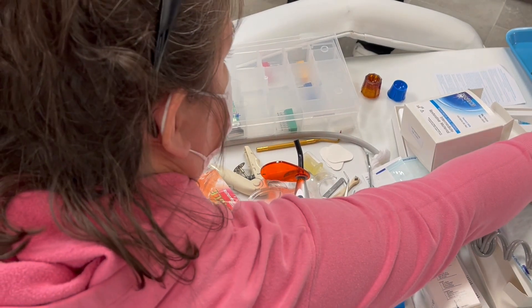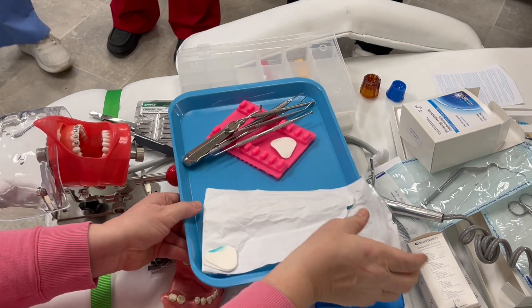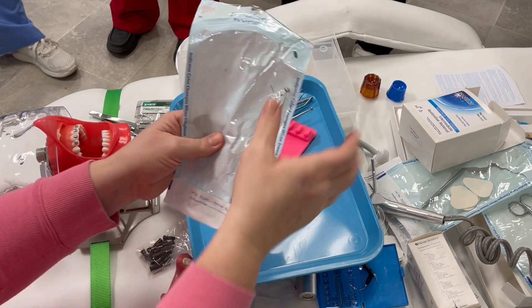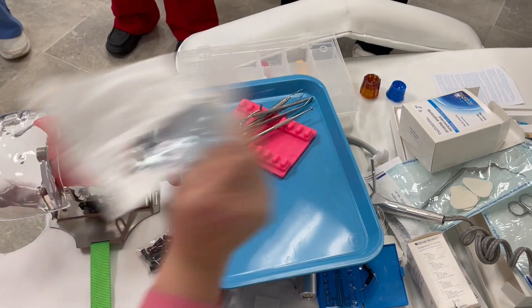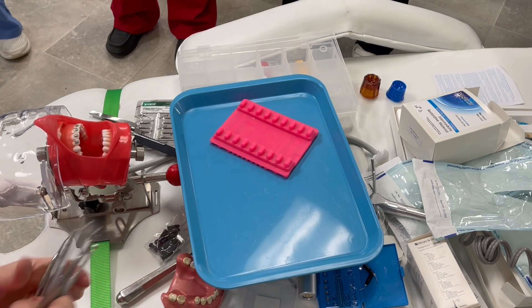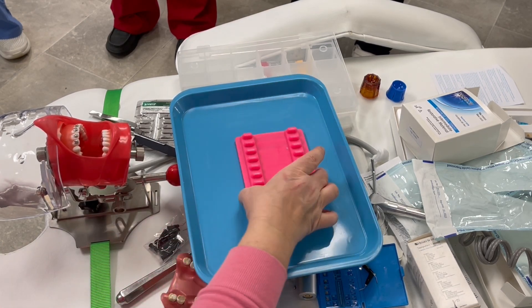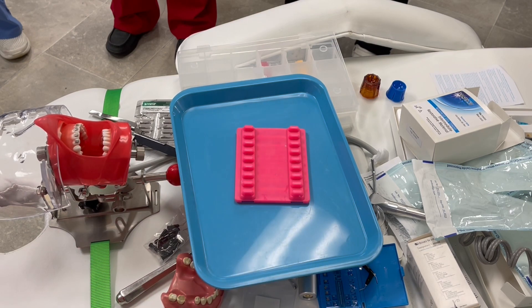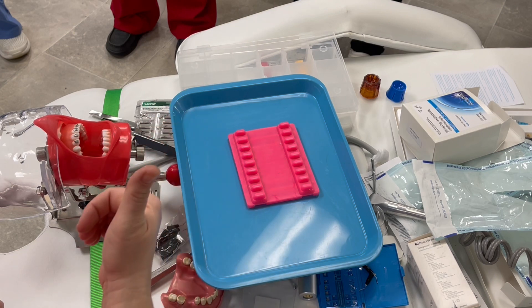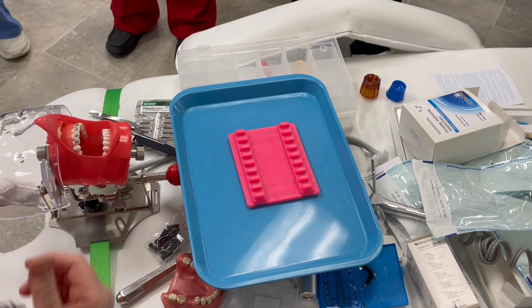The other thing I was going to go over was some of your tray setup. So for restorative, we've got all of these instruments here. What is the purpose of this little thing on a tray? To keep them from rolling, keep them separated, in order of use.